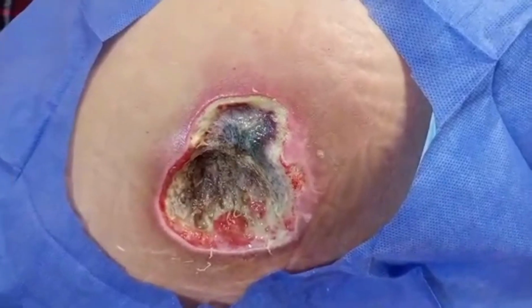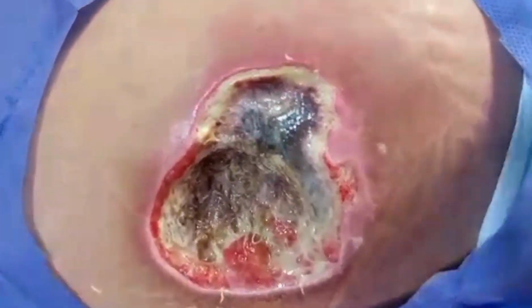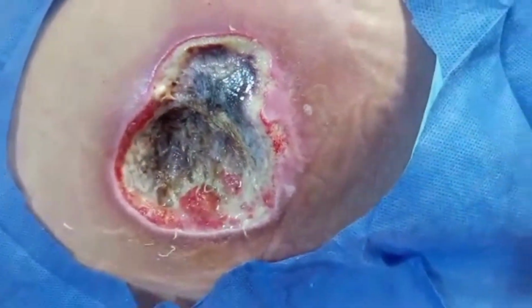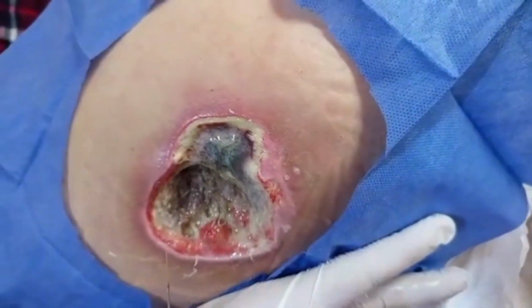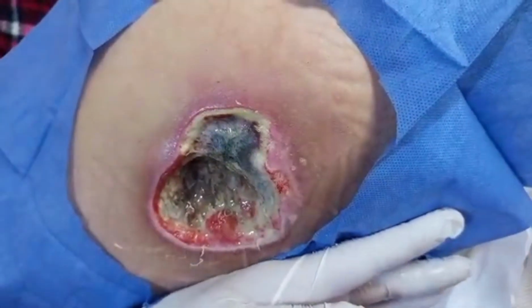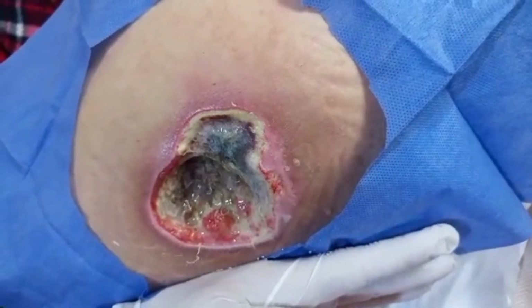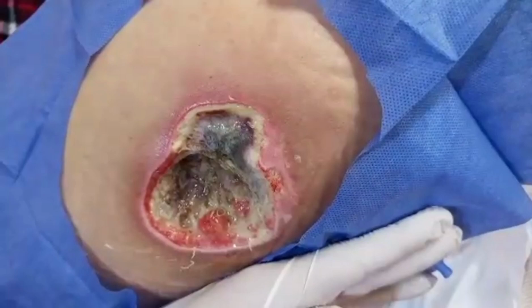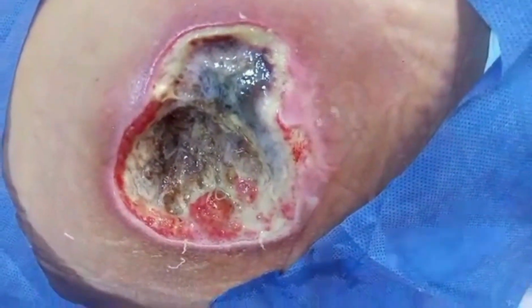Clinical debridement and field challenges. This video demonstrates a surgical debridement of advanced pressure ulcers resulting from medical neglect in developing regions. The procedure involves the excision of necrotic and liquefied tissues until reaching viable, vascularized tissue. Notably, such procedures are being performed in a home setting, whereas they should ideally be conducted in an operating theater with a specialized surgical team and sterile equipment.